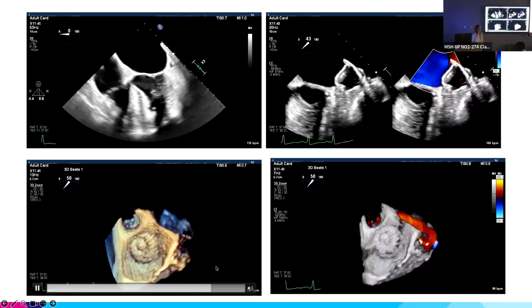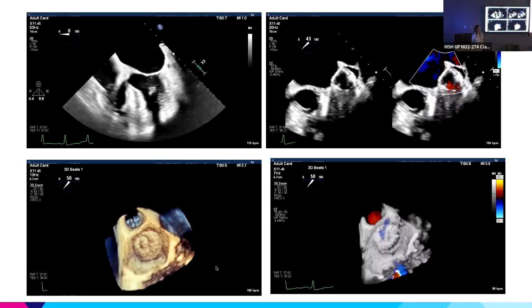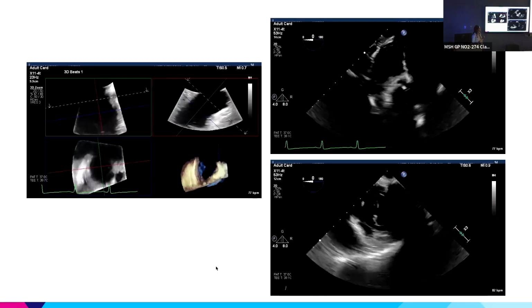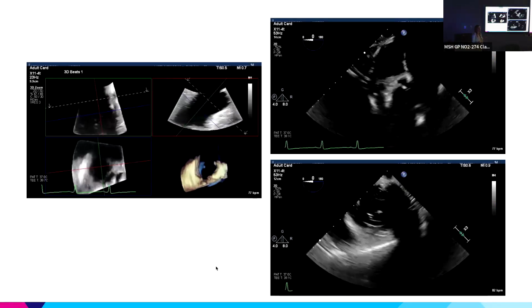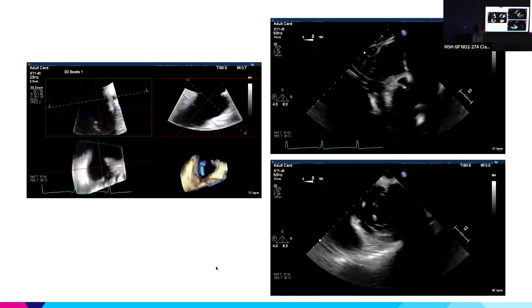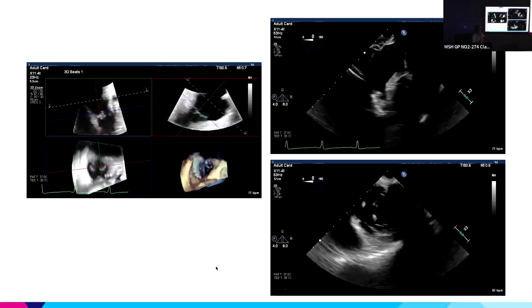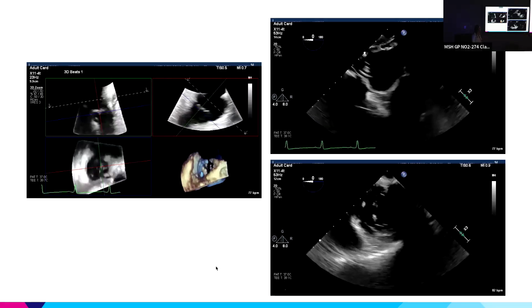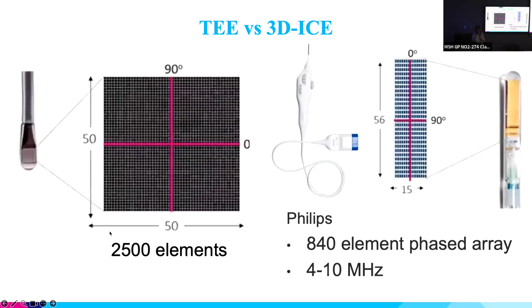If you had to use it, it's in the mid-esophageal views. It's definitely pretty good. Where the limitations tend to occur, in my opinion, is transgastric, because you need more penetration than this probe is capable of giving. You can see on top, the penetration is just not the greatest. So if you're doing a quick appendage rule-out or something that you think is going to be mid-esophageal, it's completely fine. You can use this probe. You can do Doppler, color, 3D, anything you would do with the X8 probe, you can do with the X11-4.